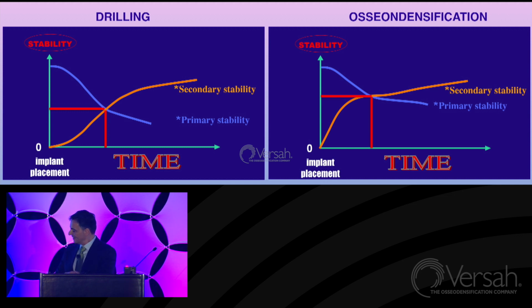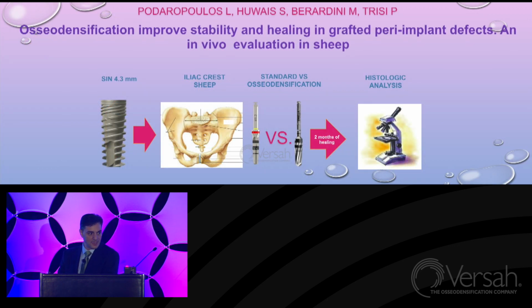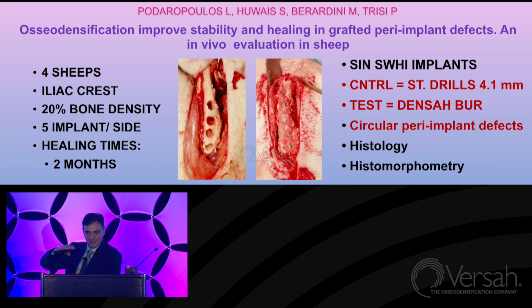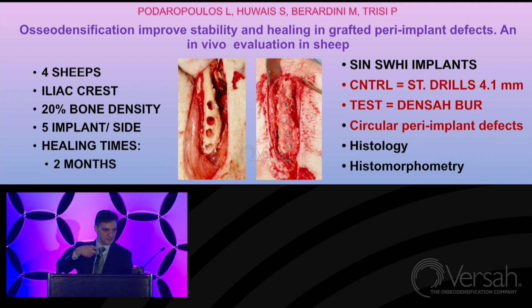I would conclude my lecture with the last study we are doing. Unfortunately, these are just preliminary results, but I wanted to show you this because we are looking at how the grafts behave when we try to densify the grafting in a post-extraction site. So we simulated a peri-implant circular defect, again in the iliac crest of the sheep, and stabilized the implant below the 5 millimeters, where the holes were stable, but in the 5 millimeters at the crest, it was larger than the implants. We placed some grafting in this defect, and we densify with the drill. Of course, it's not the same process. It's a little bit different. We are doing all the tests.